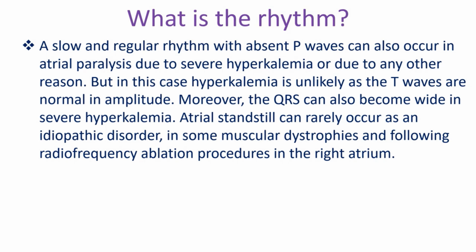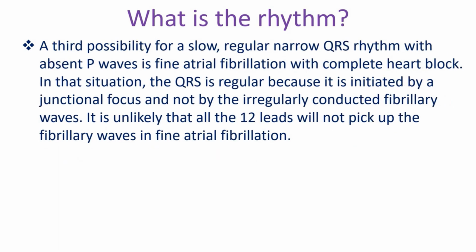But in this case, hyperkalemia is unlikely as the T waves are quite normal in amplitude. Moreover, the QRS can also become wide in severe hyperkalemia. Atrial standstill can rarely occur as an idiopathic disorder in some muscular dystrophies and following radiofrequency ablation procedures in the right atrium.